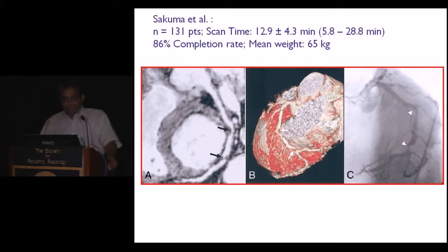So there are two major approaches to getting coronary MRA in clinical practice. One is the targeted coronary MRA protocol. This is the most widely popular method to look at proximal coronary artery vessels. So this is the only multi-center coronary MRA protocol that has been published so far. I will skip through the results. So the main use for this is that the negative predictive value of this is very high.